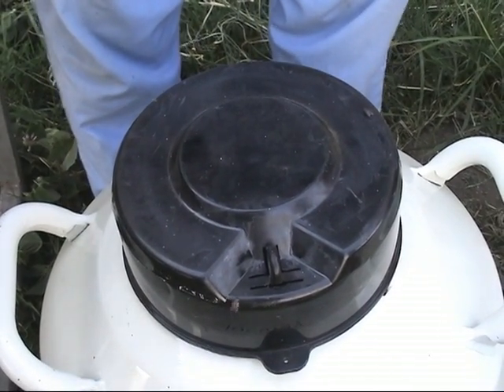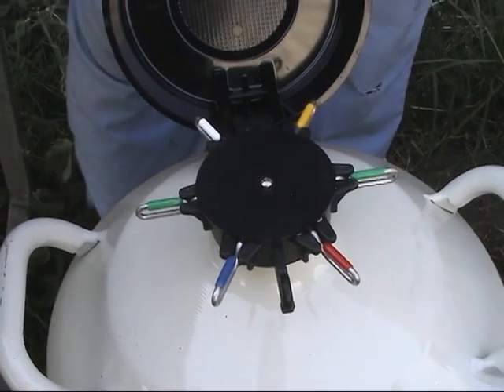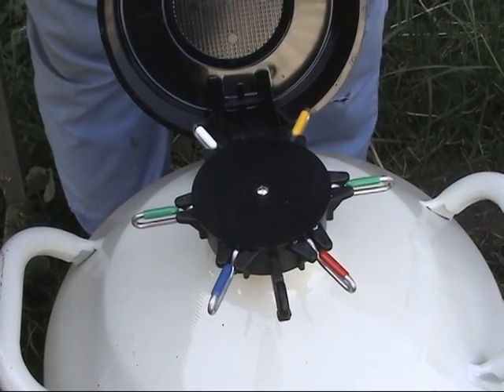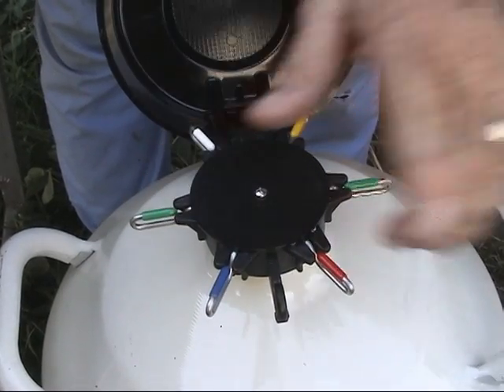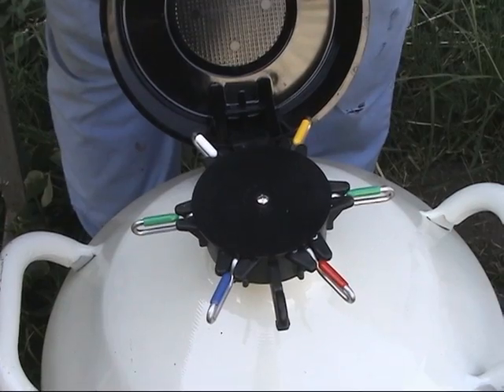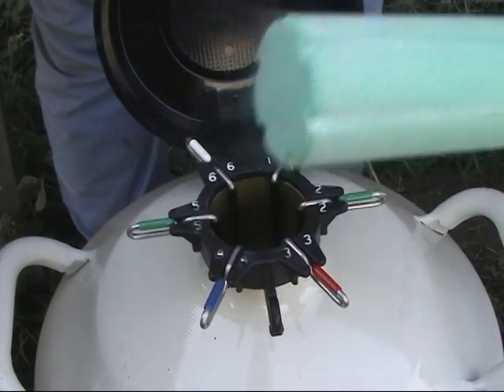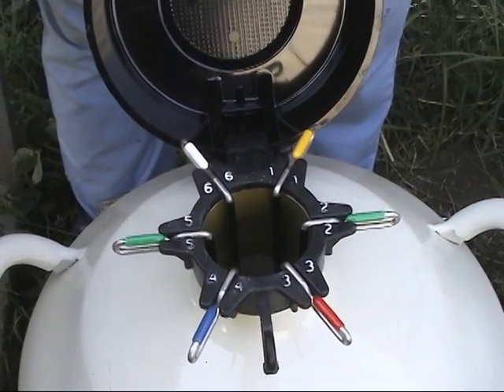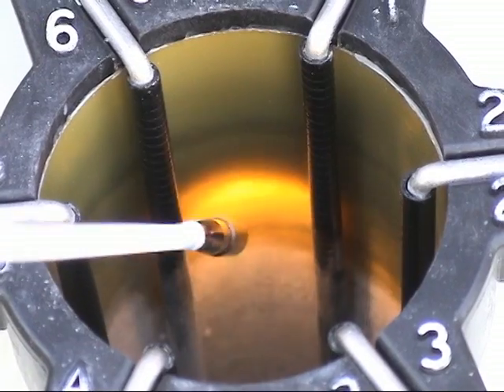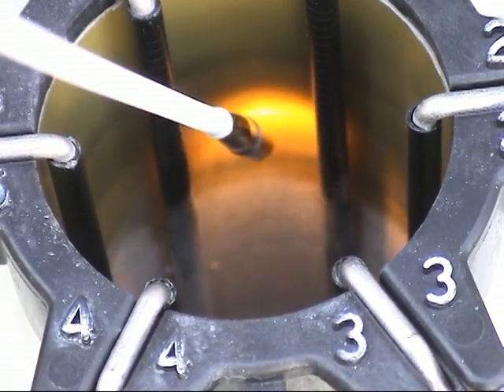We are now going to look at the inside of a semen tank to show you some important aspects. First is the cover, and you will notice a series of little tabs — each tab is connected to one of six canisters. Each canister contains semen from one sire, and it is important to keep records of which sire is in which canister. Inside the tank you will notice vapor rising from the liquid nitrogen, and on the back wall you can see the white freeze line — everything below that line is minus 175 degrees centigrade and frozen.